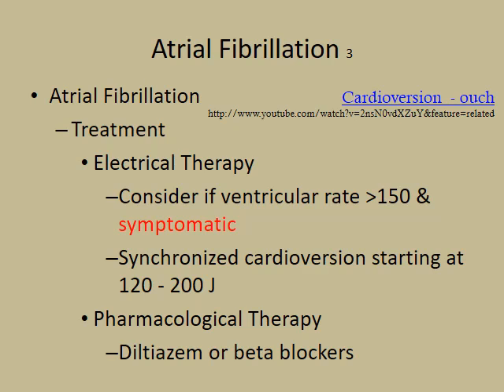Remember the steps of your synchronized cardioversion. You're going to turn on the sync button. You're going to set your energy. You're going to charge your monitor. You're going to clear your patient, and you're going to push and hold. You push and hold the shock button so the computer in that monitor synchronizes that electrical discharge on that R wave. That's for fast and unstable.